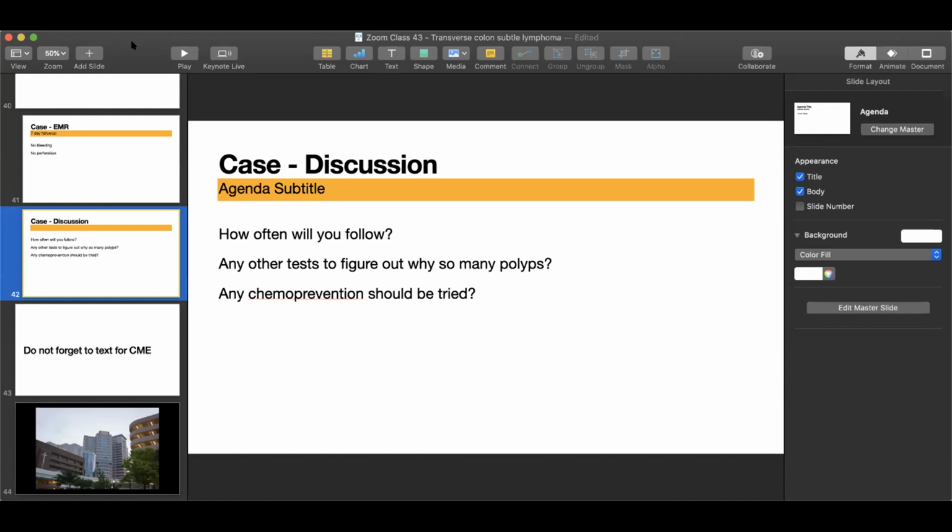So Roy, do you have a near-focus capable pediatric scope in your place? Yeah, I do. In my private practice setting, I sometimes see an SSA that's completely flat, and I insist that the facility provide me with the pediatric near focus. The reason is that when you have a petite patient, especially a younger woman, using the adult colonoscope will not be conducive.